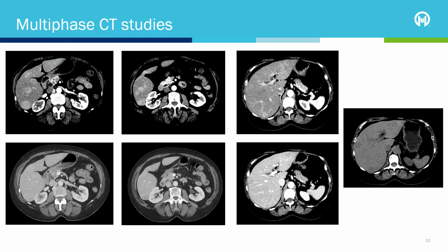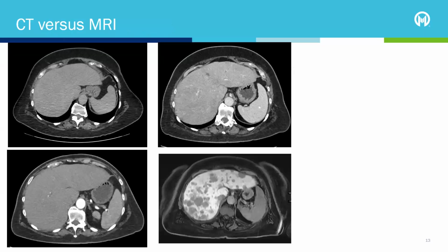But that's why the multi-phase imaging is used, and that's definitely not the standard. Like if you had colon cancer, or some of these other tumor types, that's not going to be the standard. Now maybe for detailed surgical planning for colon cancer it would be, but for some of these others, like lung cancer, melanoma, these are more common cancers, but they're not multi-phase imaging. For neuroendocrine tumor, that's why we use that.